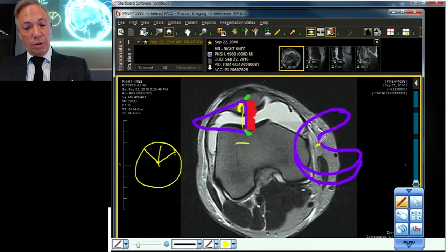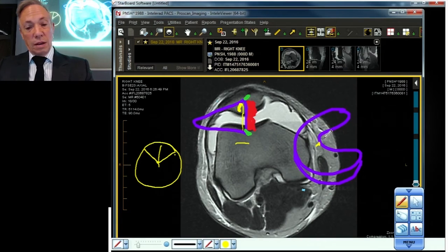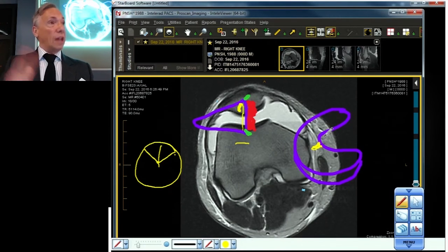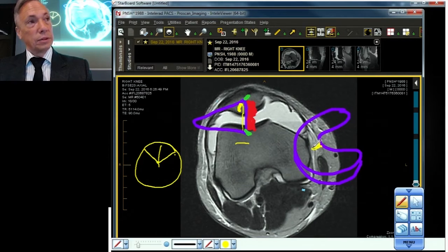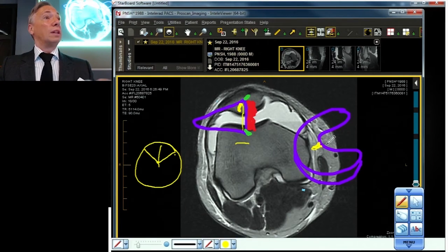So what do we mean by depth? Depth is the measurement from here, the inner edge, to the outer edge. So depth goes this way. Remember, length is completely different for the longitudinal vertical tear. For the radial vertical tear, we're more interested in this character. Now, we also have gapping, you know, the side-to-side dimension. So the tears can get a little wide, and the more gapped they are, the more troublesome they are. So depth is important, the measurement from here to here, greater than 6 to 8 millimeters, but also the side-to-side dimension, because gapping can lead to instability. Instability of what? Instability of the meniscus.